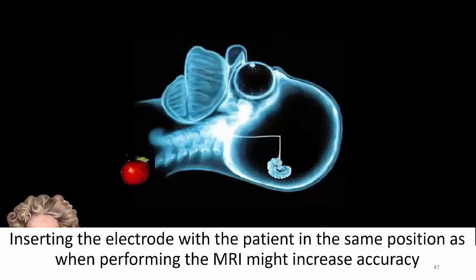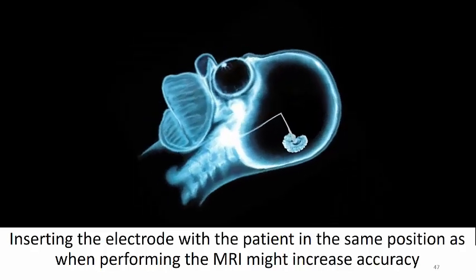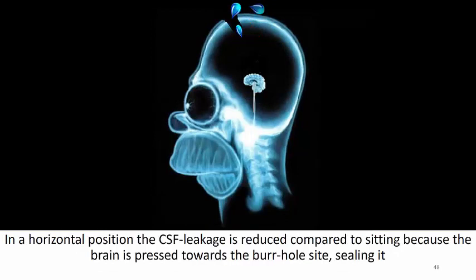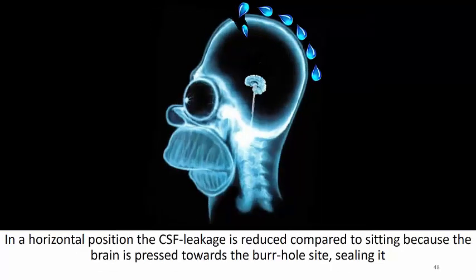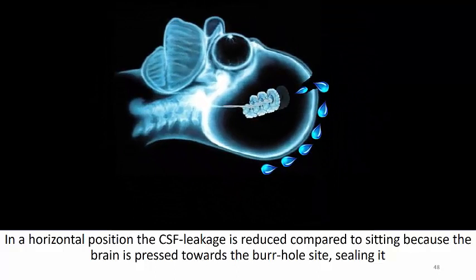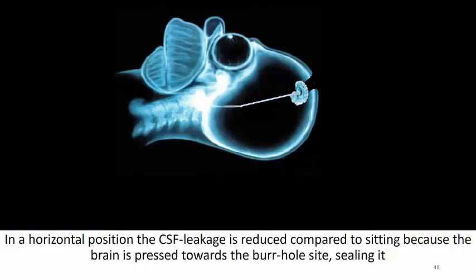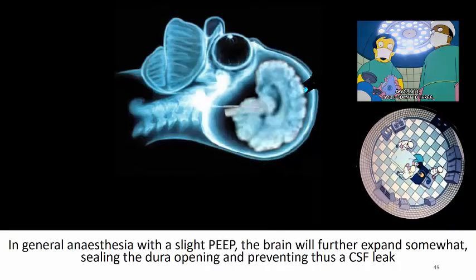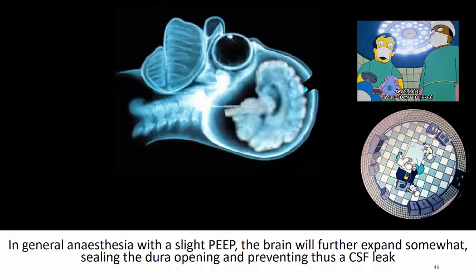Inserting the electrode with the patient in the same position as when performing the MRI might increase accuracy. Because targeting the lying brain but implanting the sitting brain might cause the electrode to end up somewhat too posterior and too high. Further, in a horizontal position, the CSF leakage is reduced compared to sitting because the brain is pressed towards the burr-hole site, thus effectively sealing it. And in general anesthesia, a slight positive pressure will contribute to this effect.